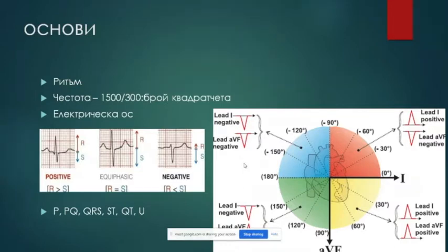So, what is the heart axis? Is it when the QRS complexes are both positive in lead 1 and aVF? No, what is the axis? What does the axis represent? It shows the electrical activity of the heart, and it is determined by the cardiac leads from the limbs. Okay, it's defined by the limb leads, and as you said, it's the electrical activity of the heart, but it's not just the electrical activity of the heart, it is where the electrical impulse goes from where to where.